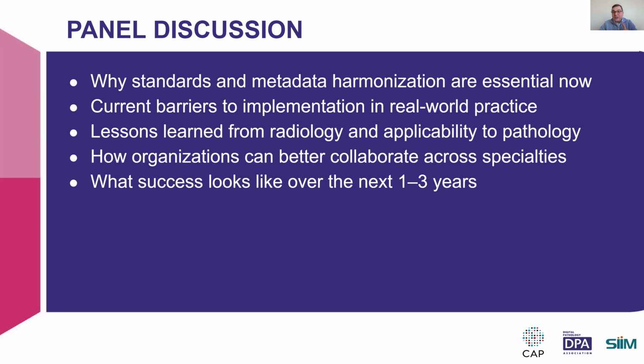And also, you need a DICOM viewer from that vendor. Unfortunately, the majority of these vendors provide DICOM, but they don't provide a viewer. So the client struggles to actually validate those DICOM images.